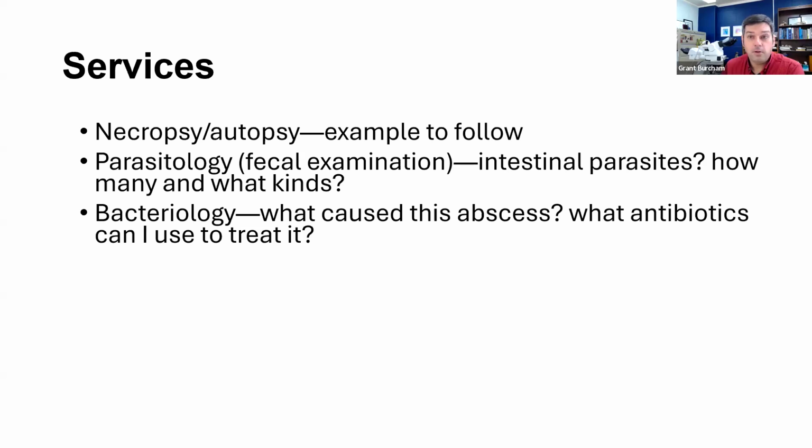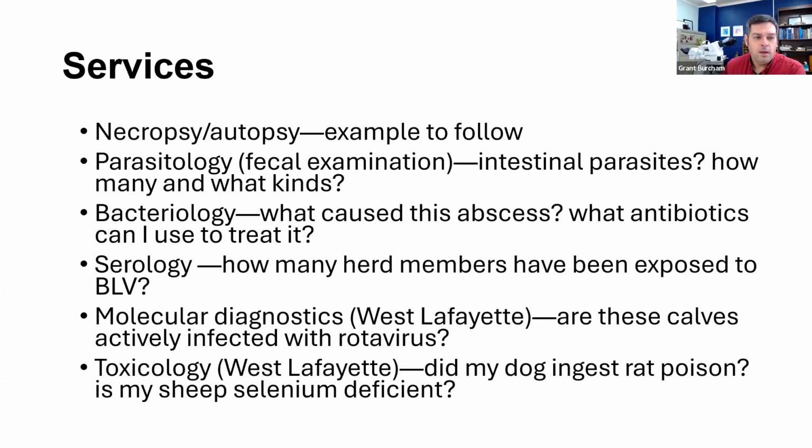We do some bacteriology or microbiology. So that might be a question like, what caused this abscess on my animal? What antibiotics can I use to treat it? And broadly, not just abscesses, but any type of bacterial disease, of course. We do serology, which some people may know as blood work. We can answer questions like, how many members of my herd have been exposed to bovine leukemia virus? That's a question that we can answer with serology.